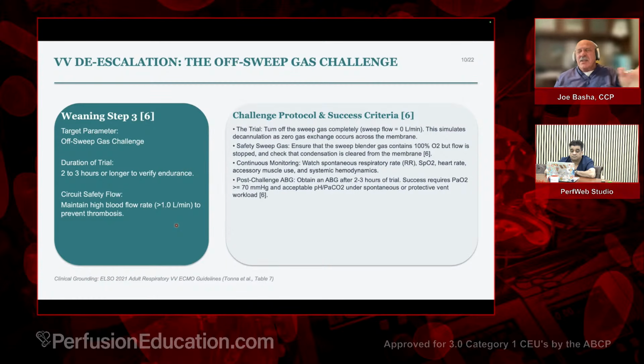Just remember you did it, so if you have to go back up, you don't turn it back on and wonder, well, why is it not going back up again? Oh, because we disconnected it. I mean, that would be silly, but I guess it theoretically could happen. So just turn it off. No sweep is no sweep. There's no therapeutic benefit whatsoever.